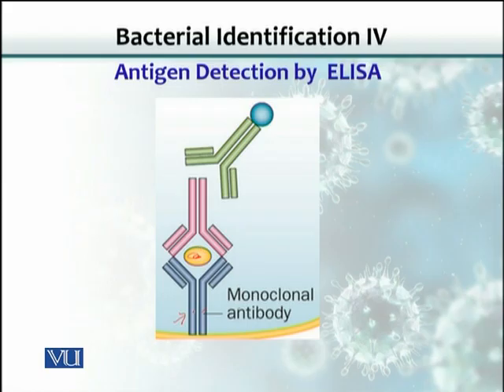between the two antibodies. And now the presence of this antibody is detected by another anti-antibody, which is against this portion of the antibody. And this antibody we already labeled with an enzyme, for example, here. This is an enzyme. We put the substrate at the end, and this would give us a color. And that color indicates that this antigen was there in the system.